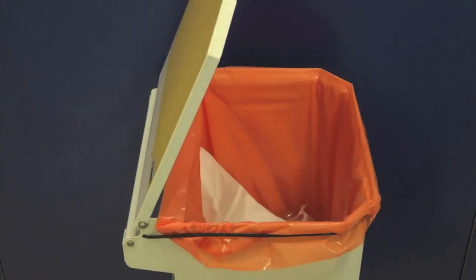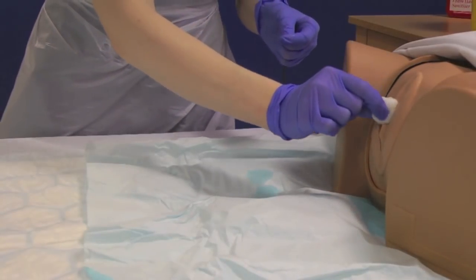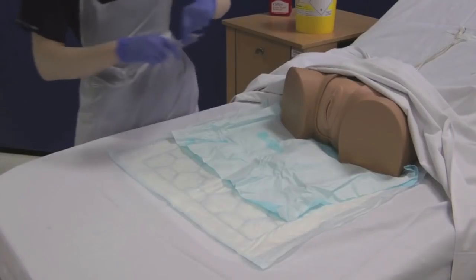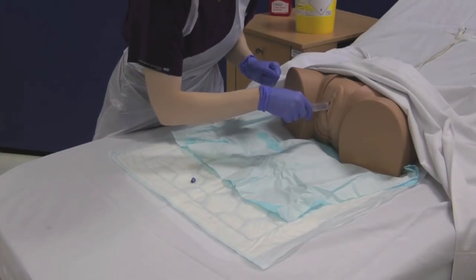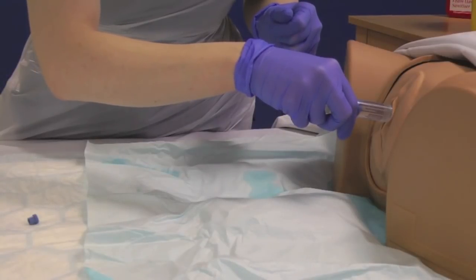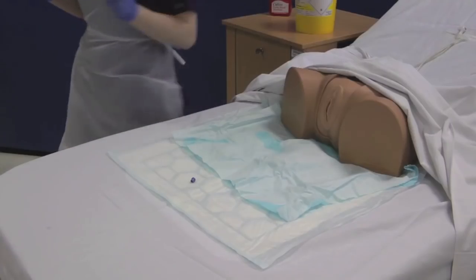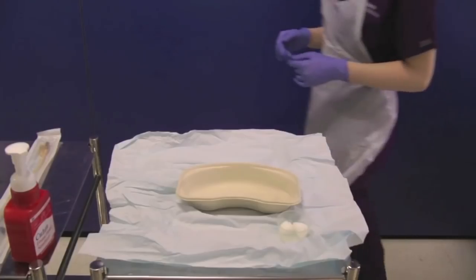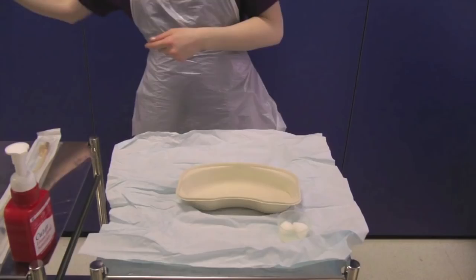Use a minimum of 5 cotton wool balls, cleaning from front to back, symmetrically from outside to in. Once you have finished cleaning the genitalia, take your Instillagel and insert only 6 milliliters into the urethra. Dispose of the syringe into the sharps bin. Allow 5 minutes for the gel to take effect. Remove your gloves and decontaminate your hands.